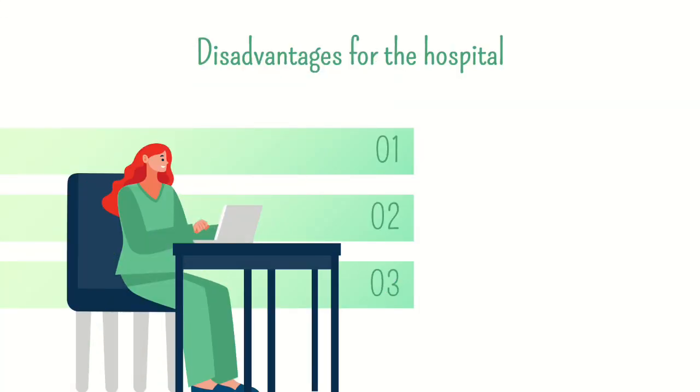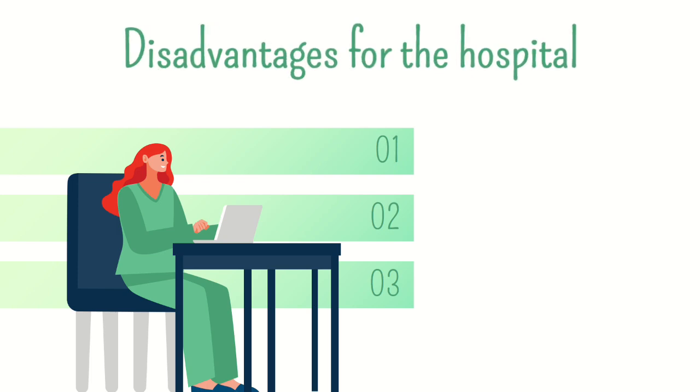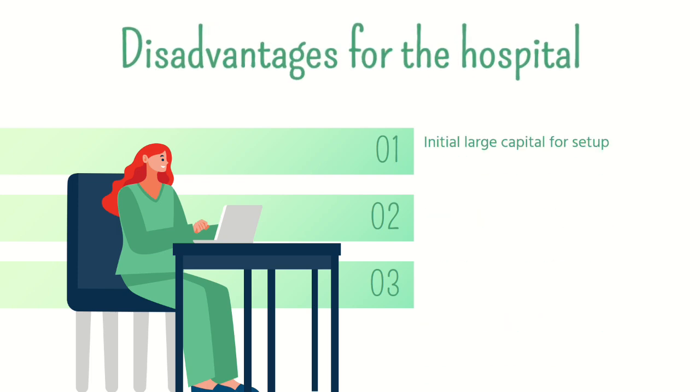The disadvantage, however, is that it needs an initial large capital for setup. Laparoscopy equipment is not cheap. With that being said, laparoscopy also has an expensive upkeep. Hospitals should provide specialized training for their personnel to take care of the equipment.